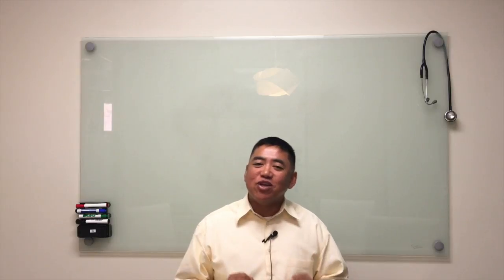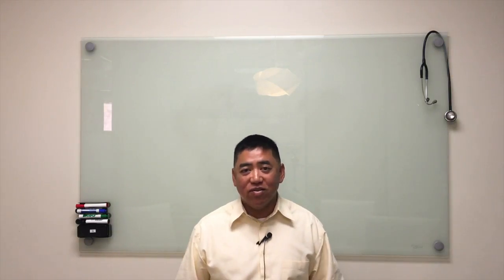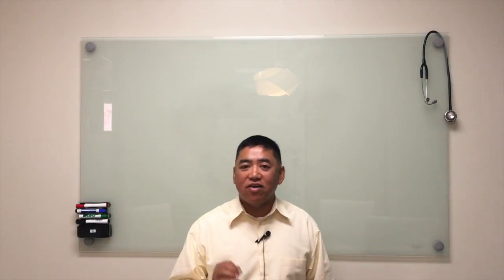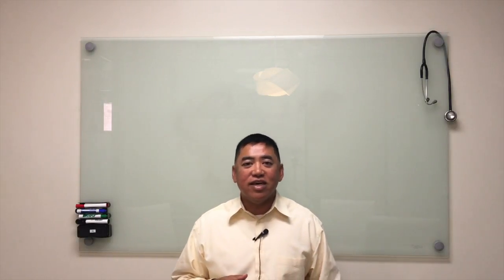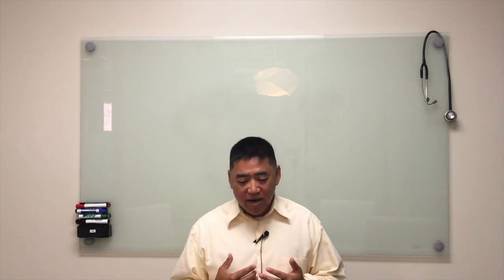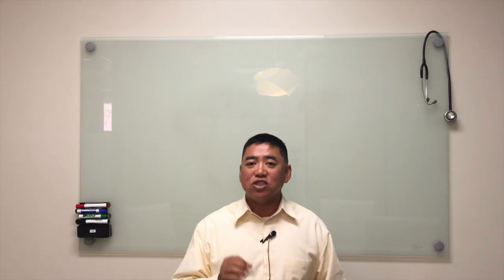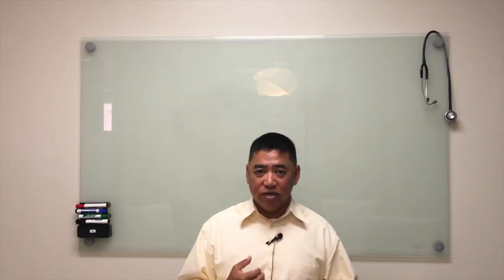All right, my name is Dr. Geronimo, and this is probably the most important video that I've ever made. Today, I'm going to give you guys an important diagnostic tool that could possibly save your life. It's called the coronary calcium score. It's a CT scan of your heart that identifies the major arteries and looks for calcium deposits or blockages in those arteries.